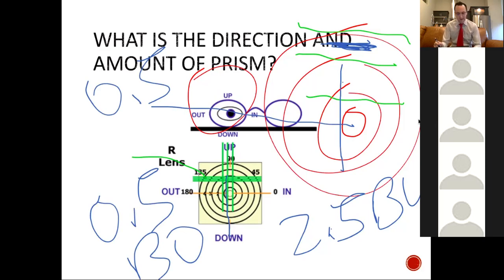And perhaps on the exam, they'll just show you this image of the relationship between the target and the reticule, just to make sure that you know how to use it properly, right?